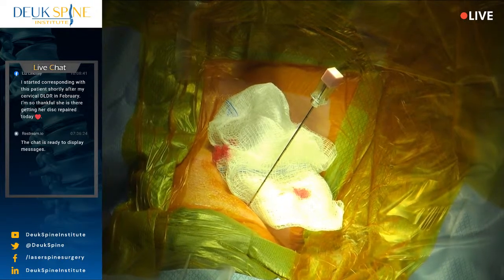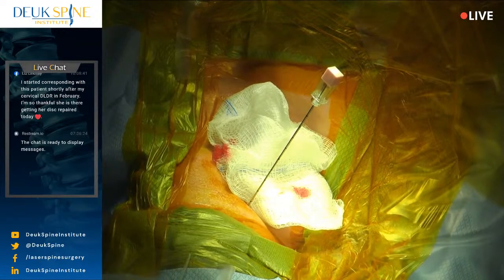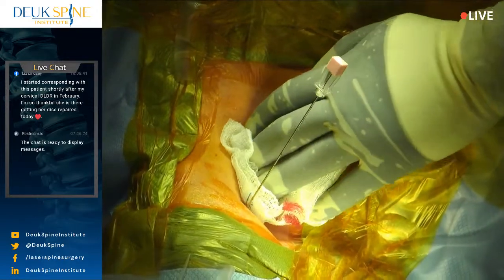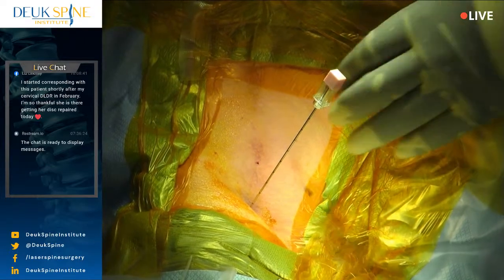All right, so how can we let that happen? It should never happen. It's supposed to be straight up and down. If you twist the body, you twist the spine. It makes my job a lot harder, which is already hard enough to do this. Yes, sir. All right, are we good? We're gonna give this a try.